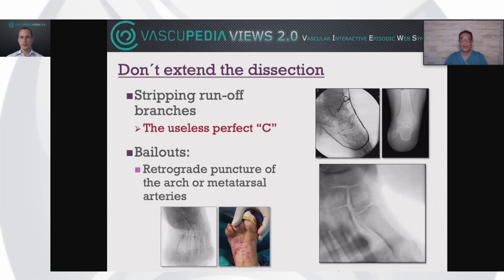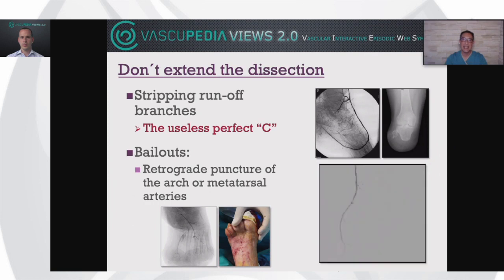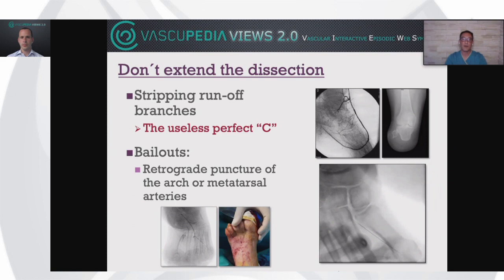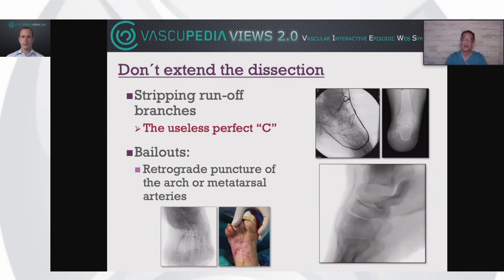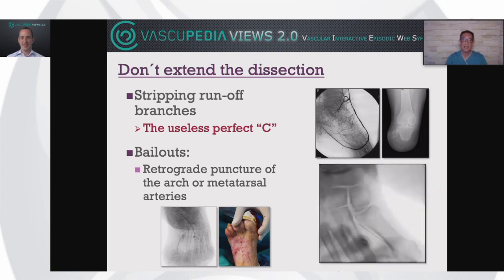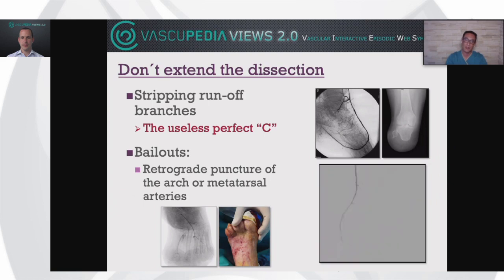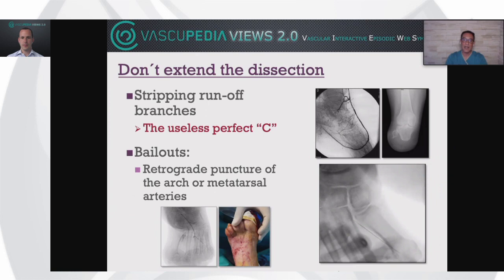For me, this is the key point, the most important message of our presentation. Don't extend your dissection into the arch, because you will end up stripping the runoff branches, and you will get these nice, fancy, and sexy pictures to show to your colleagues, but completely useless. Believe me, completely useless. It's what we call the useless perfect C. And if you get entrapped in such a situation, you need to look for the back door. So you will need to perform a retrograde puncture of any digital artery or the plantar arch itself.